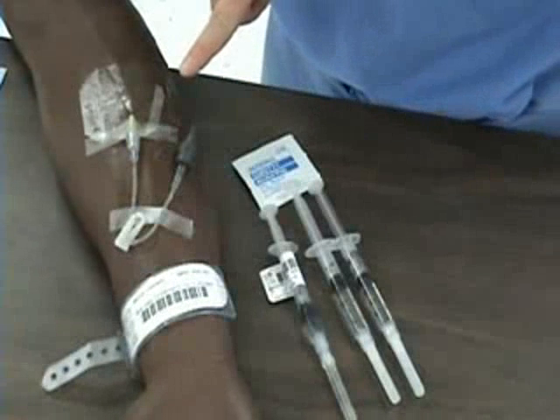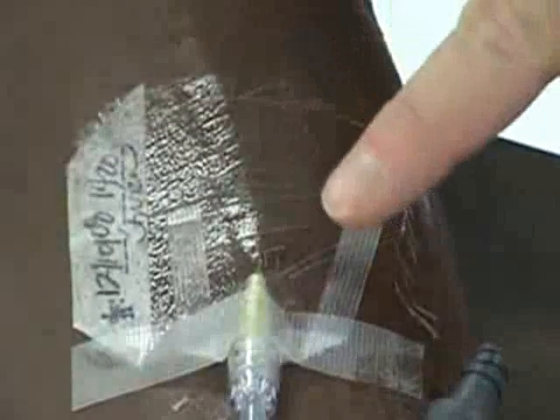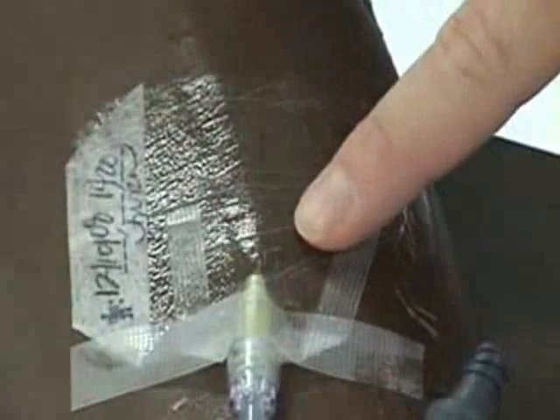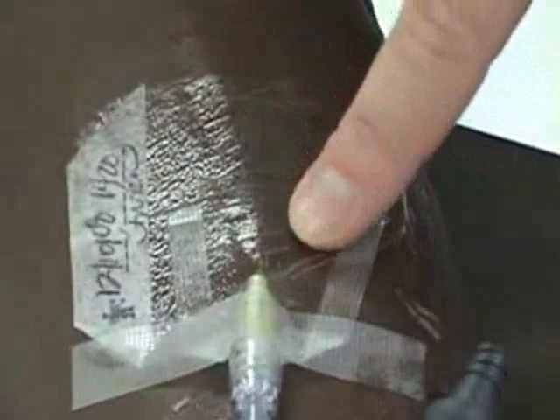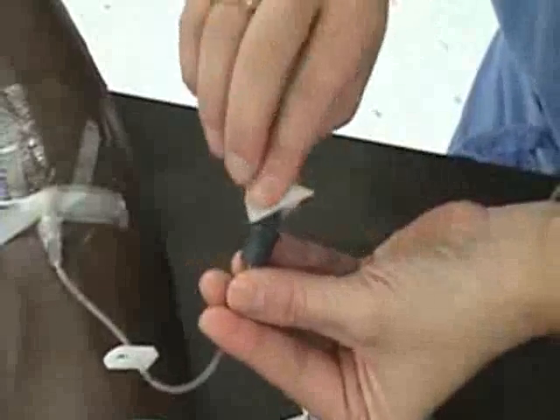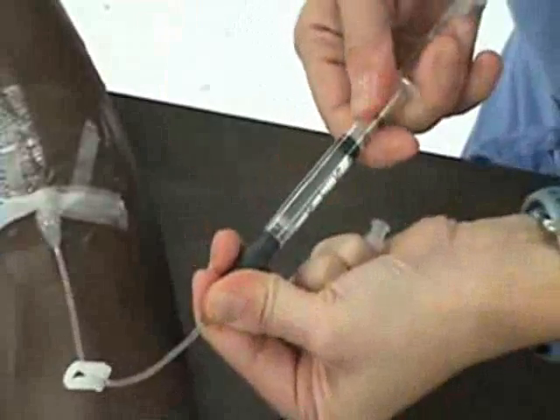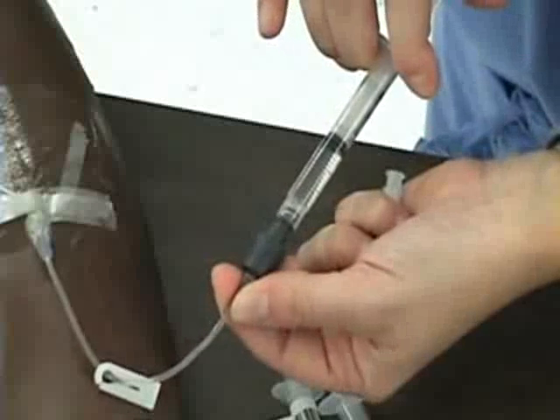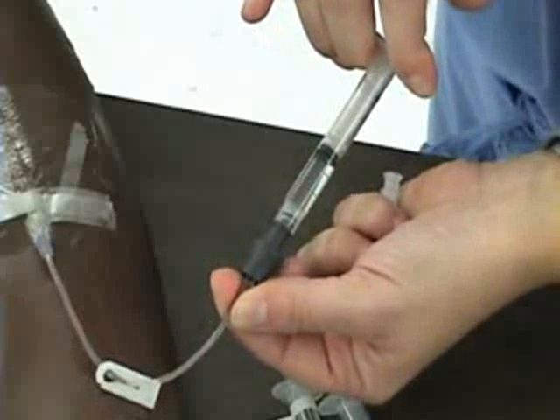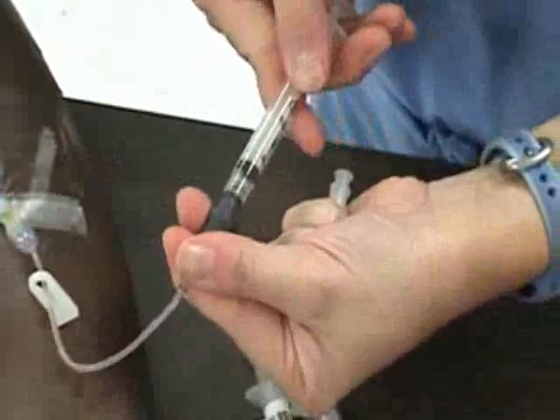Before administering the medication, I want to check the IV site. I see no evidence of infection, infiltration, or phlebitis at the IV site. The patient does not report any pain. I will swipe the port with alcohol. I'll attach my saline flush by twisting and then unlock the clamp. I will flush slowly and check with my patient to see if he is having any pain. I will dispose of the syringe and cap in the sharps container.